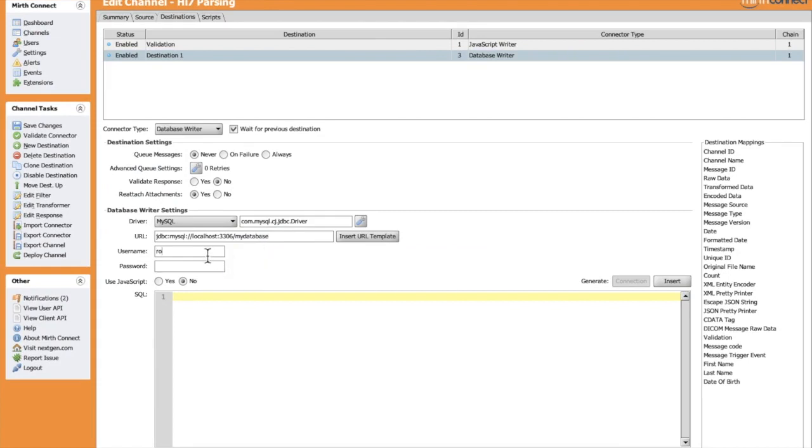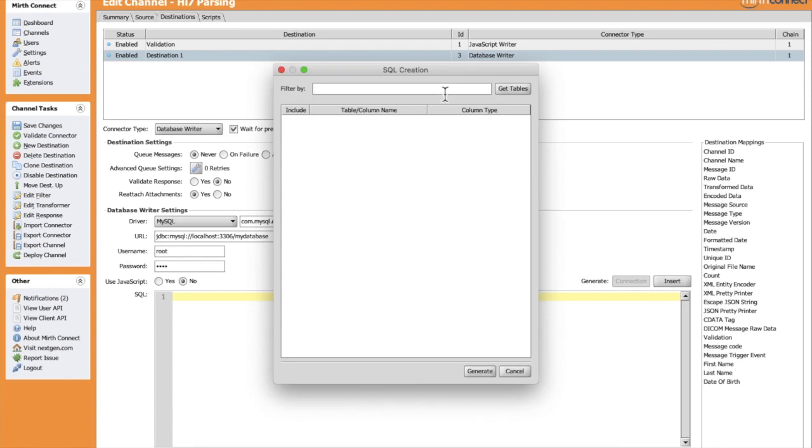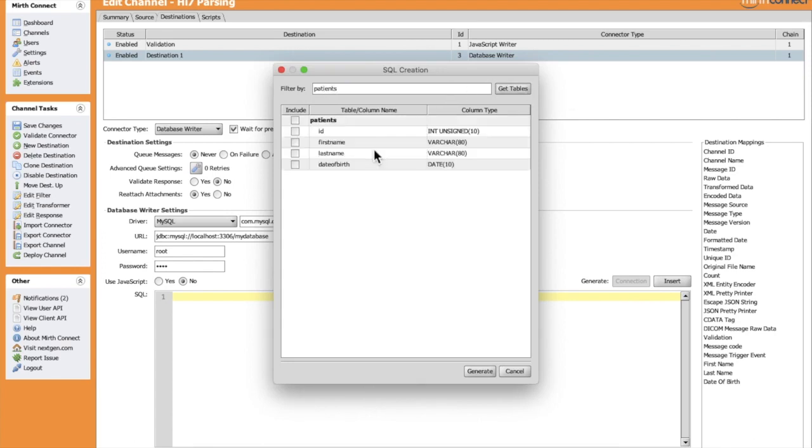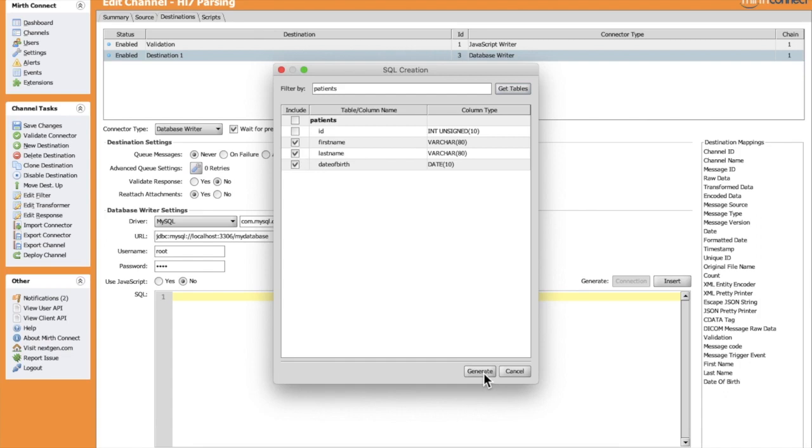To write an insert query, we can do it manually or choose the easy way by clicking Insert and picking the tables where we're going to insert the data. Let's look for the Patient table. The connection is working, and Mirth Connect found our tables. Let's pick the columns we will use: first name, last name, and date of birth. When we click Generate, Mirth Connect will generate an insert query.